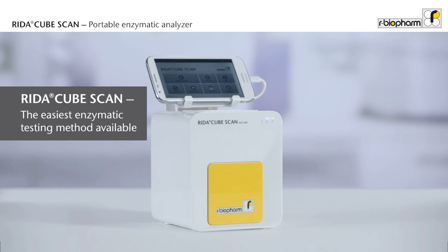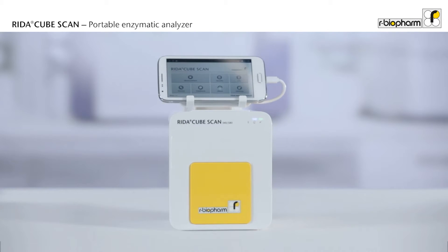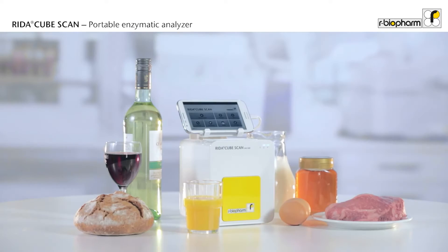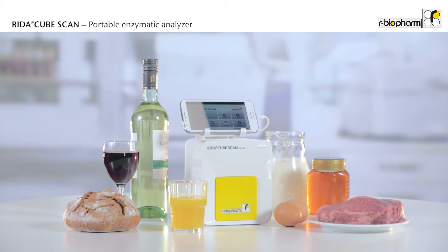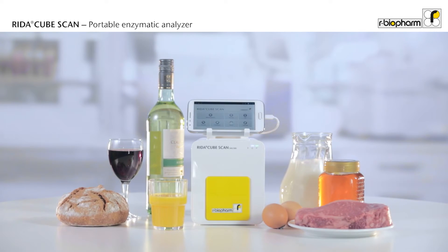Discover the RIDAR CubeScan, the smart way for single tests in enzymatic analysis. This walk-away analyzer is incredibly small and delivers the result in 15 minutes with only one pipetting step. The RIDAR CubeScan allows covering all enzymatic assays for the detection of organic acids, sugars, or other food components in a very large variety of food samples.